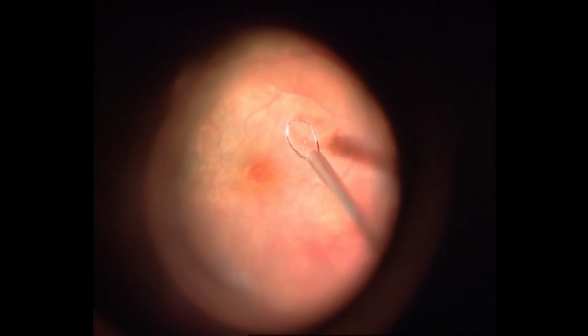The residual autologous gluconated blood clumps on the macular surface are utilized for internal limiting membrane peeling in this patient who underwent a combined phaco-vitrectomy for visually significant cataract along with vitreomacular traction.